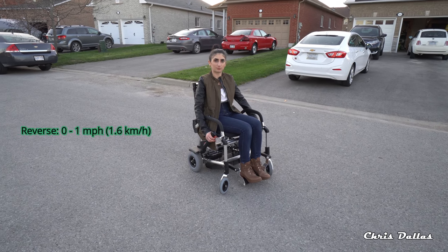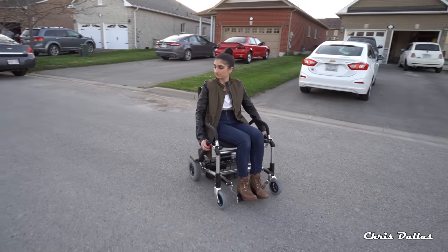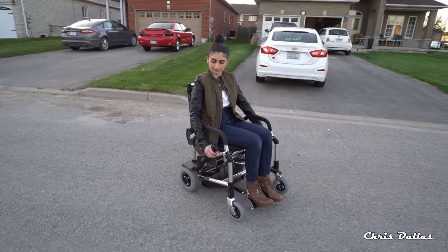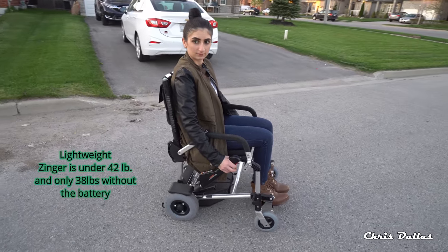Reverse? When it's in reverse, it beeps. So if you're going backwards, there's only one speed in reverse, but at least it beeps and lets somebody behind you know.